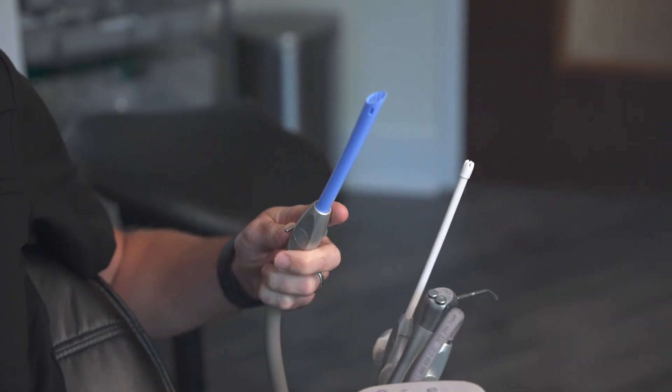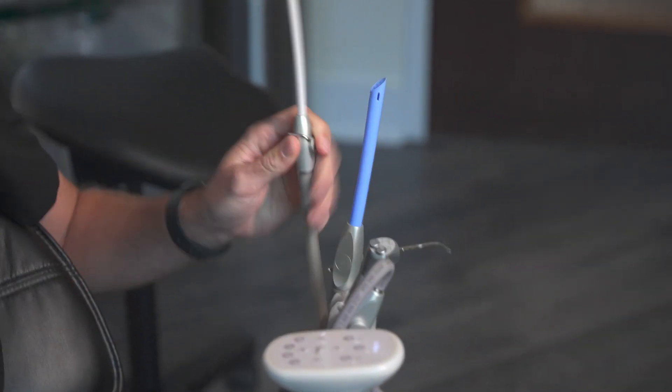This one we call the high vac. It sucks a lot of air. Don't put your mouth around this — it's gonna take your breath away. Instead, this is the small vac. Much smaller, better to get your saliva for you. It won't take your breath away, trust me.